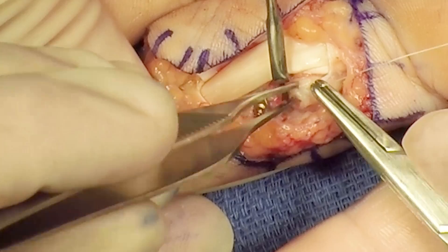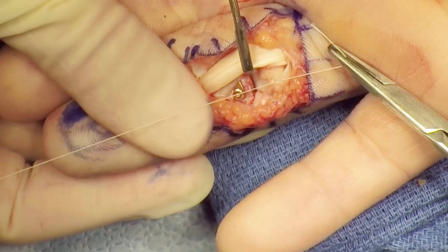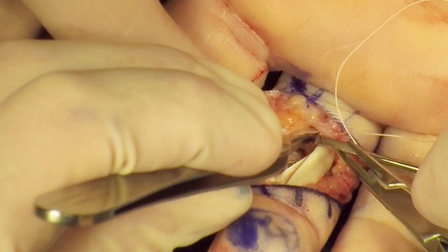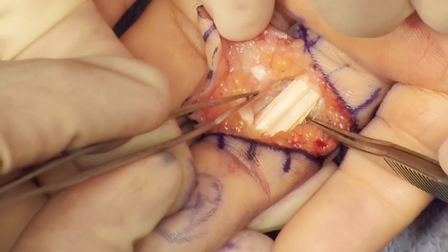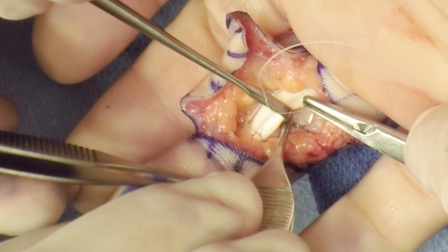The volar plate is then repaired to the collateral ligament in order to prevent volar instability. The flexor sheath is then positioned dorsal to the flexor tendons to cover the plate and restore a smooth gliding surface for the flexor tendons.